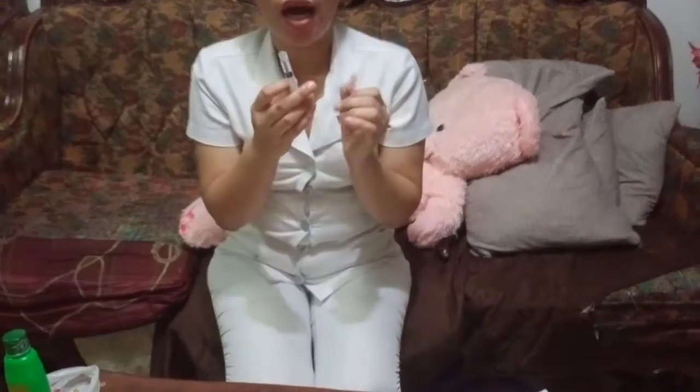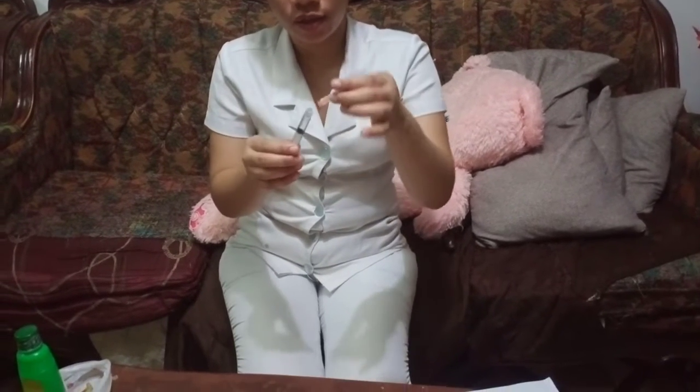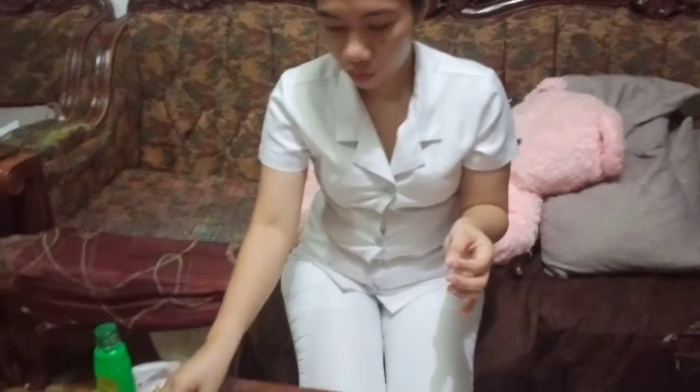Then, if giving an injection, replace the filter needle with another needle before giving to the patient, and push the solution to the needle. So I'm done pushing the air up the needle. Then, assuming that I have another aspirating needle, I'm going to attach it again. So now I'm done preparing the medication.